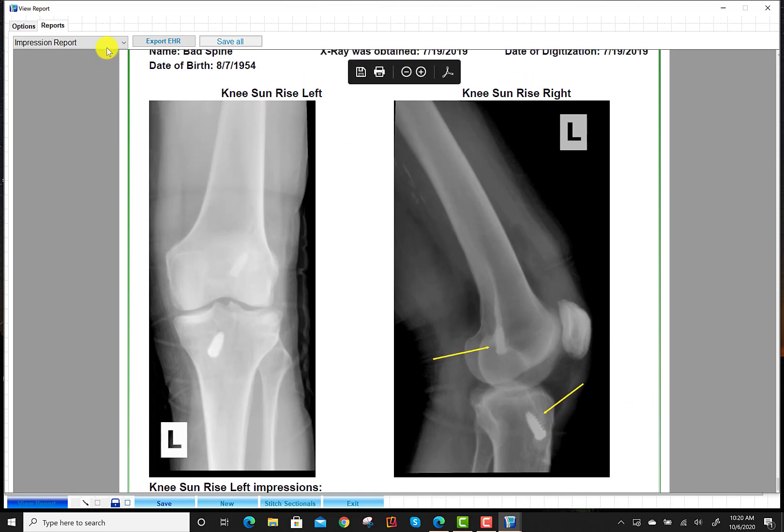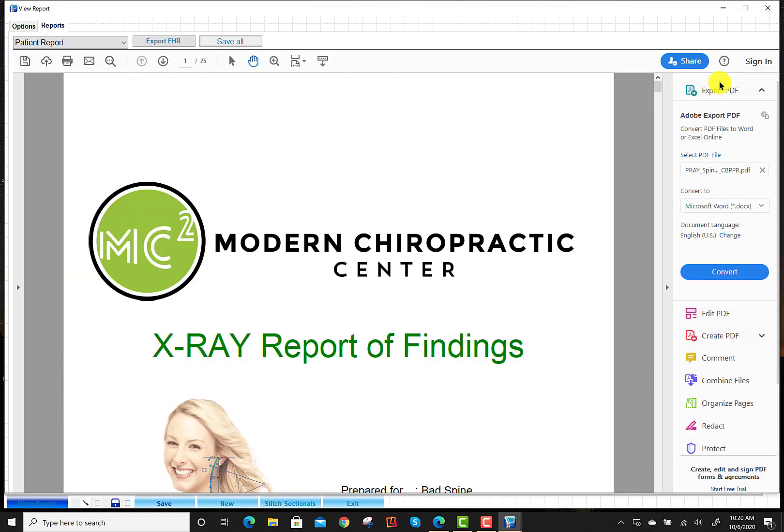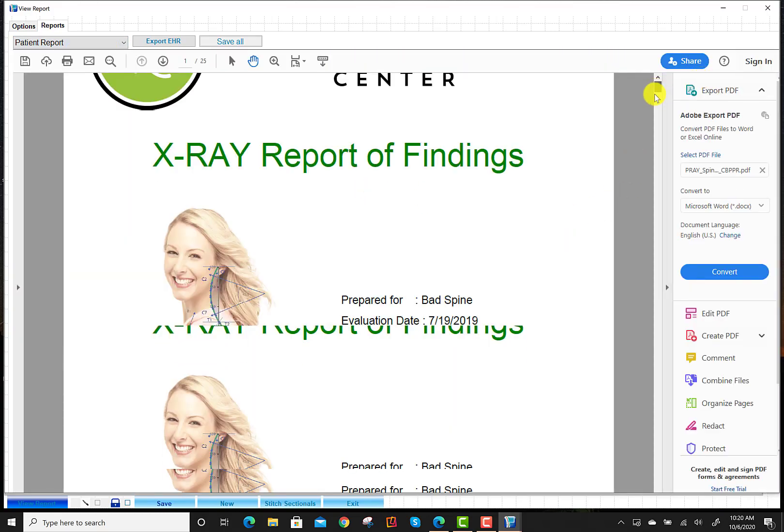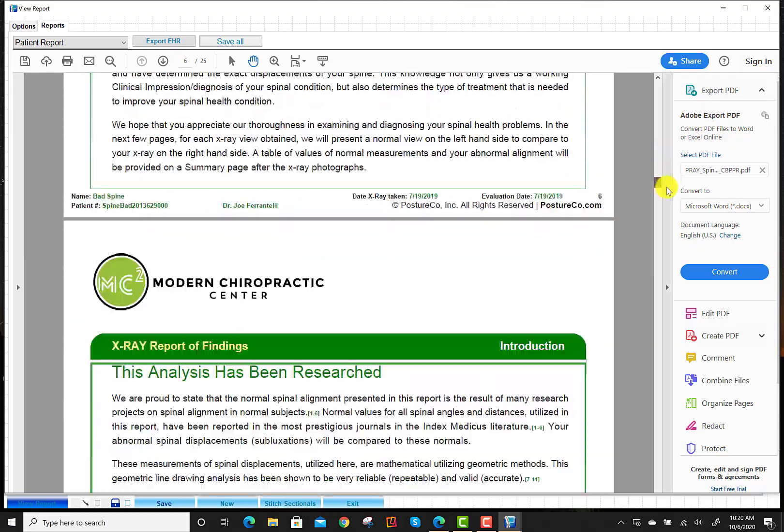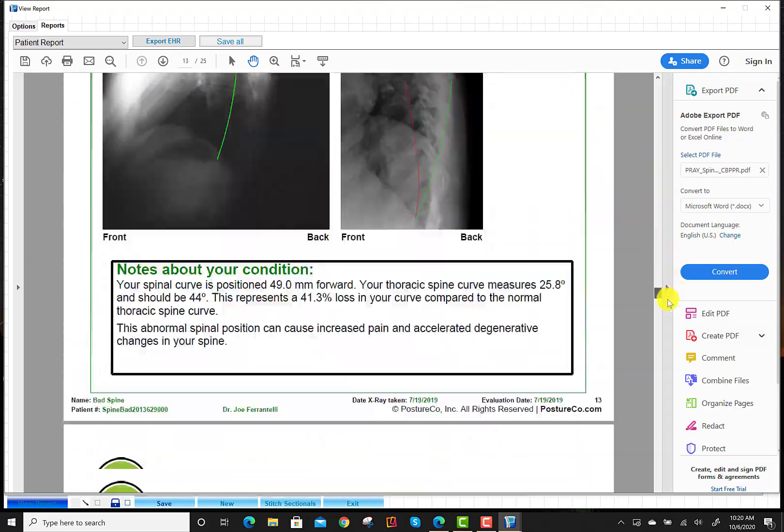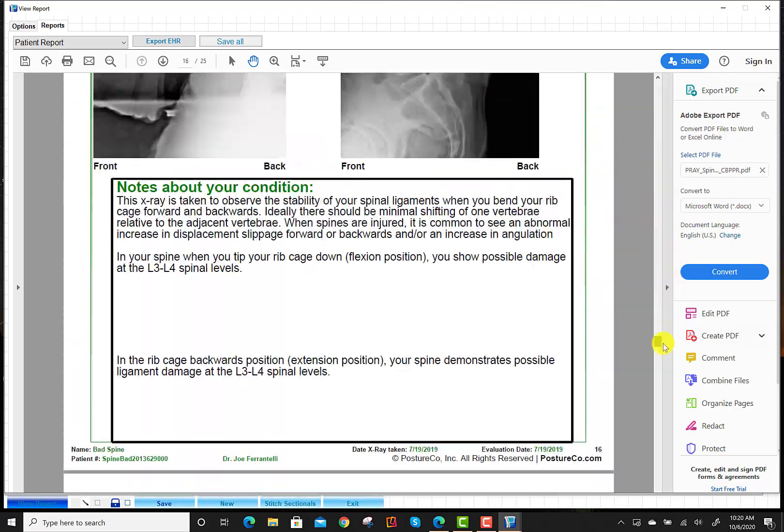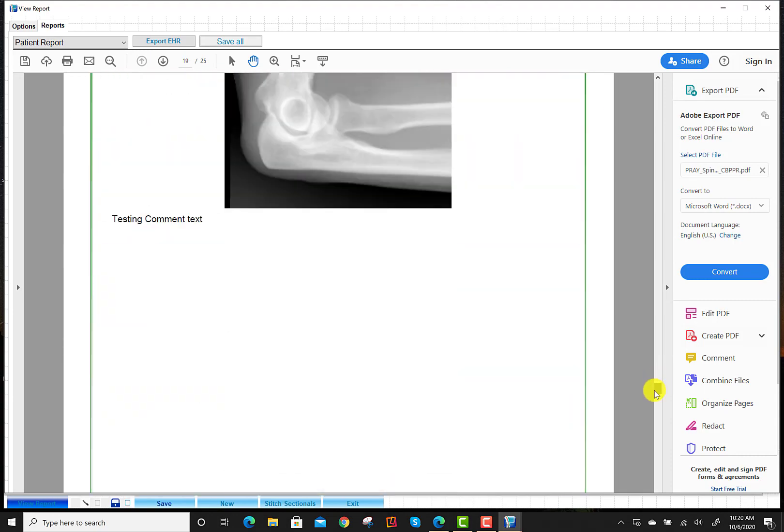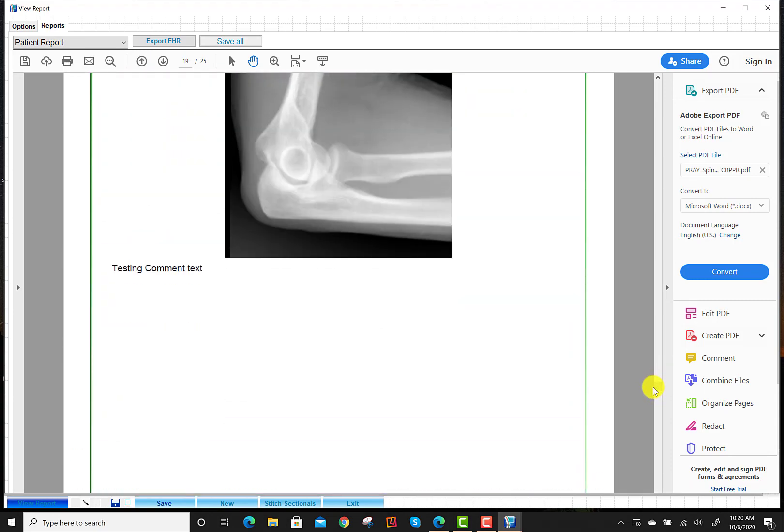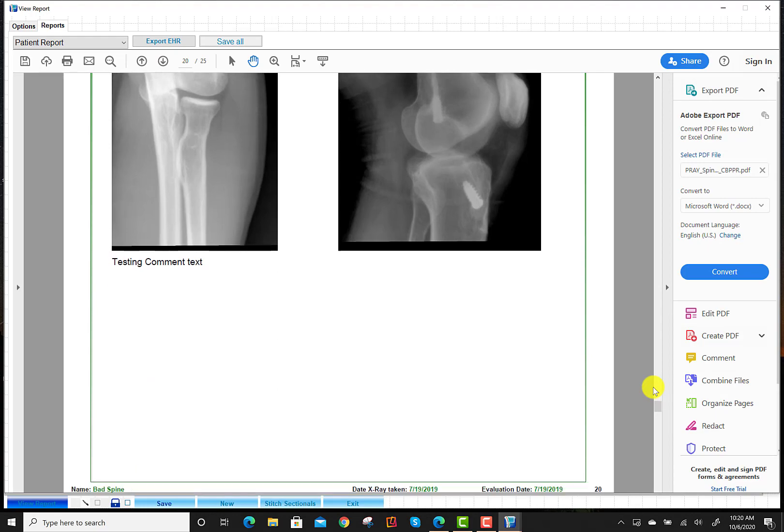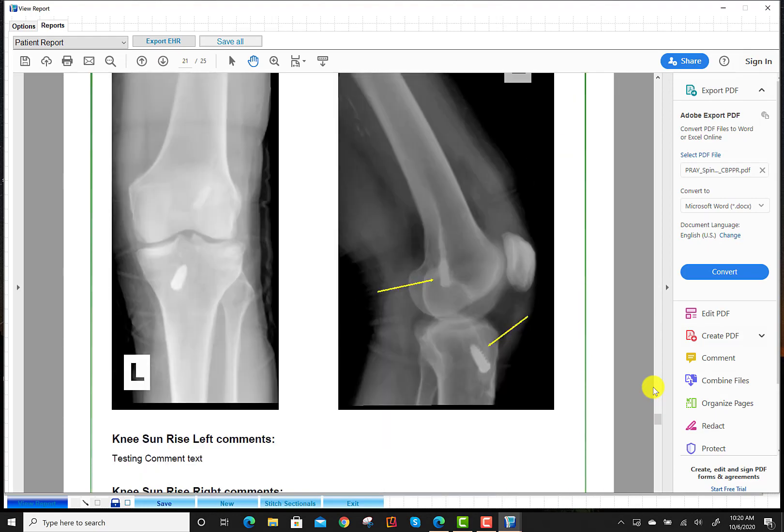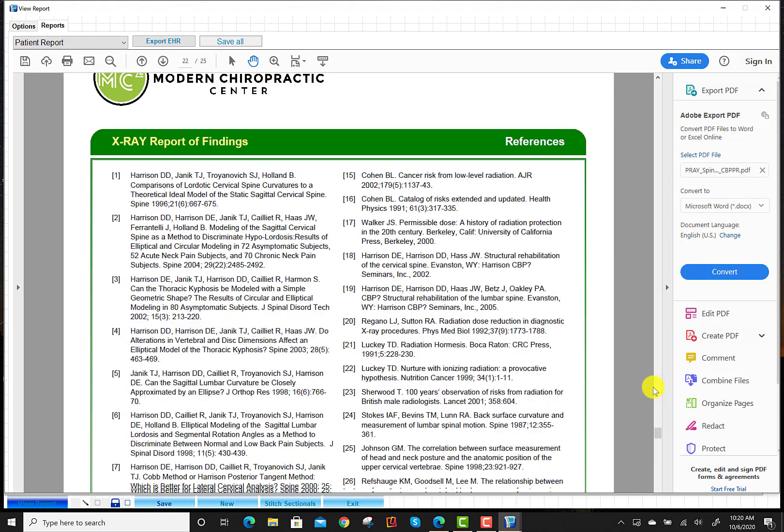With that being said, in the patient view, same thing. Let's go ahead and scroll down. And you're going to see it's in the patient format now. So here, again, we can write comments and text to the patient.